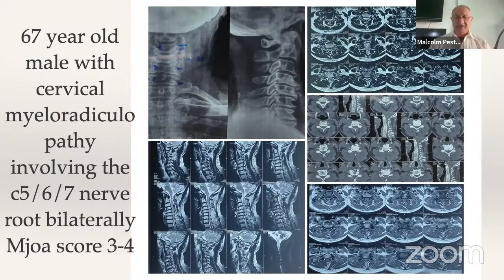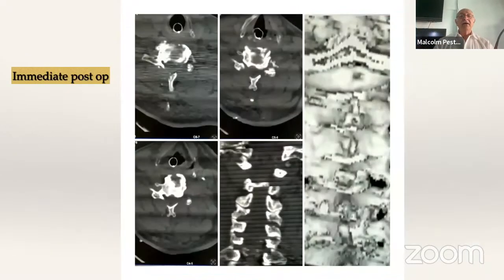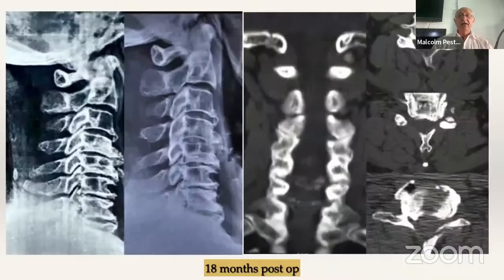He was not able to walk unassisted. And you can see here that we have done 6 sides, 3 on either side. We have done foraminotomies. We have a floating tip technique. We have done hemilaminectomies on contralateral sides. And this is the 18-month follow-up.